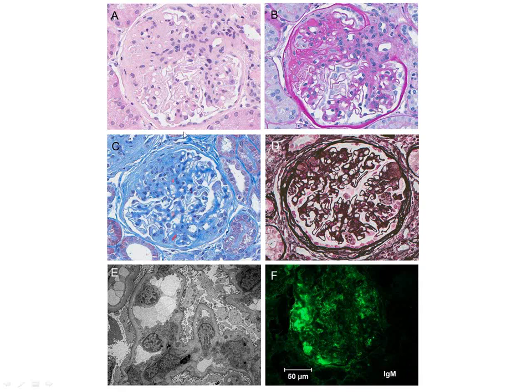Aside from that segment, the glomerular capillary loops are open. The glomerular basement membrane is of normal thickness. And specifically on the PAS stain, right here where my arrow is, that is a podocyte with protein droplets. And you guys can all see that on your screen, hopefully. Also on the PAS, we can see podocytes. So here's clearly a podocyte, here's clearly a podocyte, here's clearly a podocyte, and they are subjectively hypertrophic.